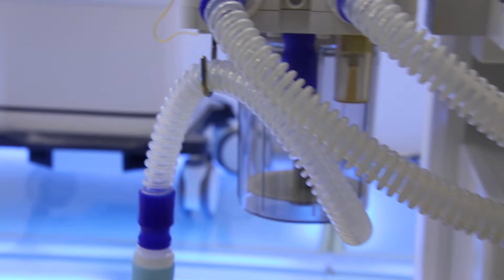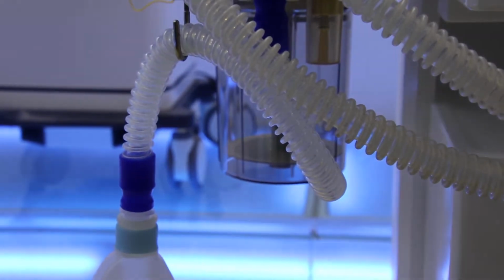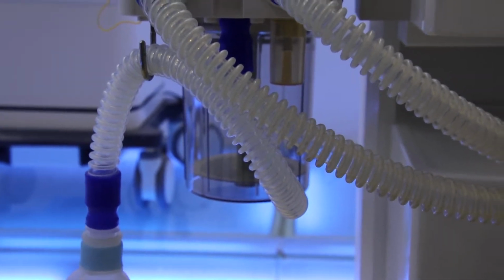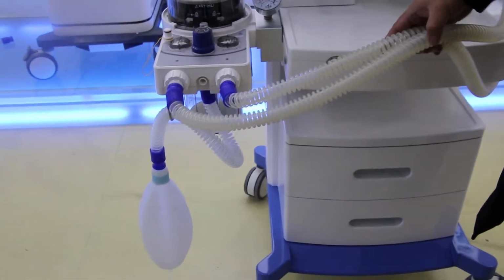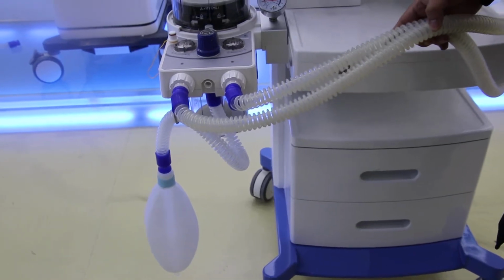It can hold a total of 1.5 liters of the carbon dioxide absorbent, and you can use different types to keep the water dry. For the pipeline here, we are using the reusable one. Usually we can use it for 3 or 4 months, but it still depends on the usage frequency.